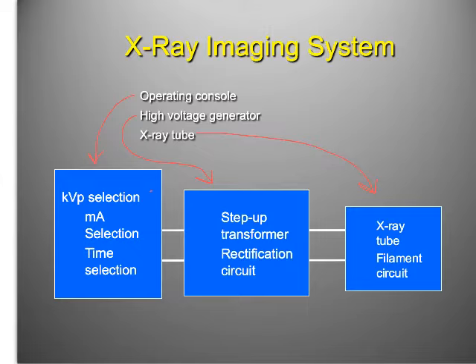Moving over, the high voltage generator has a step-up transformer, right? That sounds dangerous to me. If you have a transformer that's stepping up power, it's doing significant work. On this illustration on figure 8.1, that's E, the step-up transformer. He may have spent some time talking about turns ratio and stuff like that. The important thing here is that there are more secondary turns.